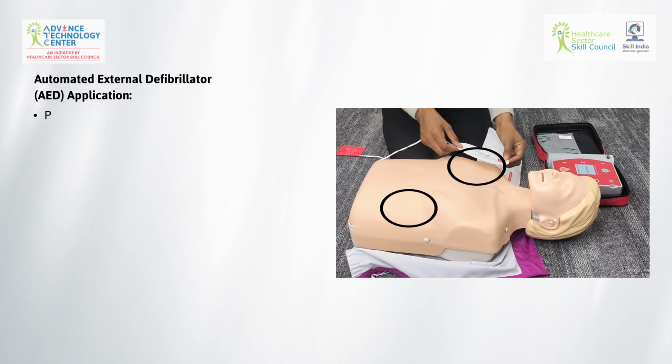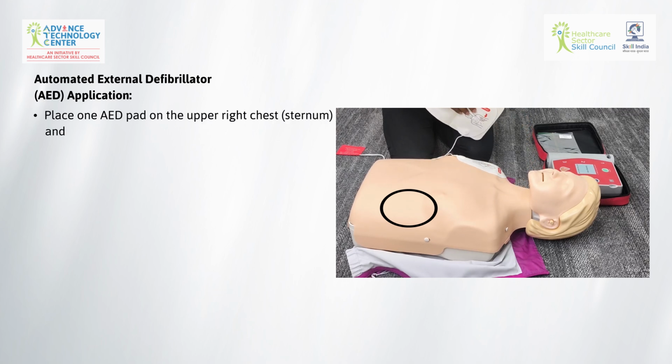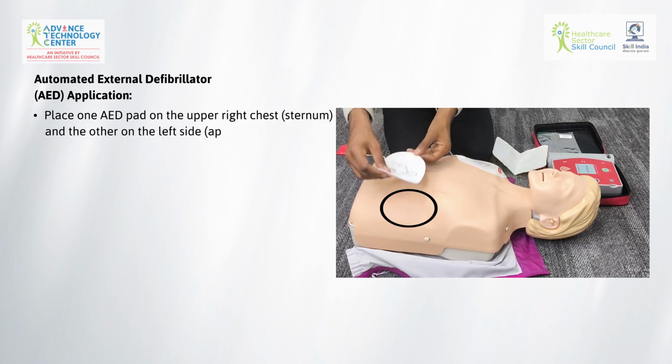Automated external defibrillator, AED, application. Place 1 AED pad on the upper right chest, sternum, and the other on the left side, apex of the heart.